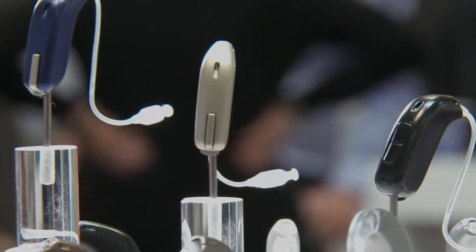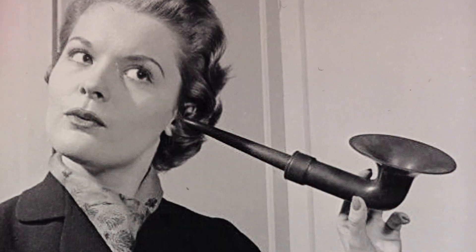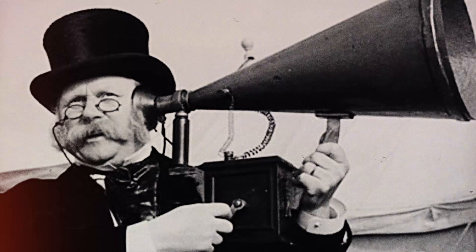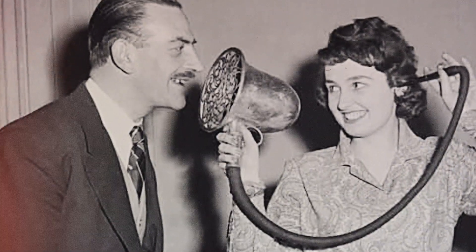Although they sound like a recent invention, hearing aids have been around as early as the 17th century, although at that time they weren't as small and nifty as they are today. They were in the form of large trumpets that increased the audible sound pressure to augment hearing difficulties.